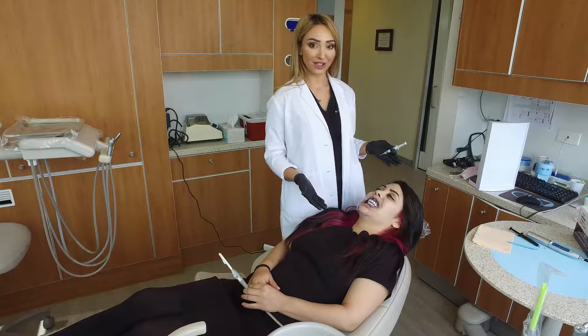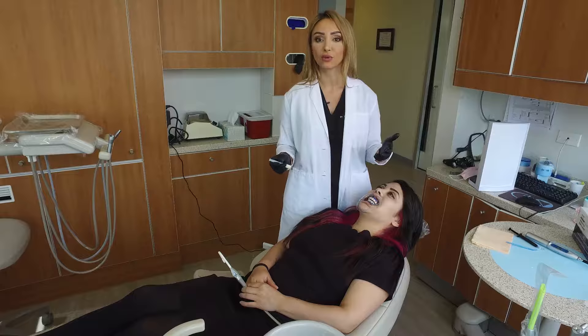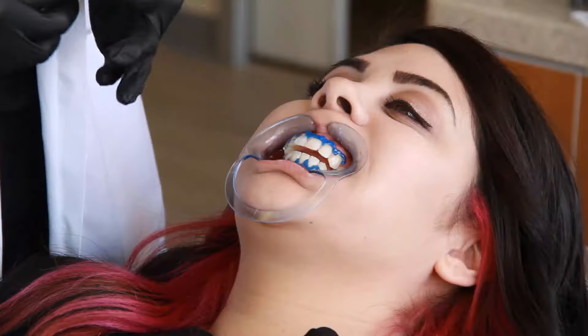Now that we've made her look like a jack-o-lantern — but she still looks pretty darn good — we're going to put some whitening agent on the tooth. Then we bring over the light. The light makes the stuff a lot more potent and actually converts your teeth to be about three to four shades whiter in about an hour.